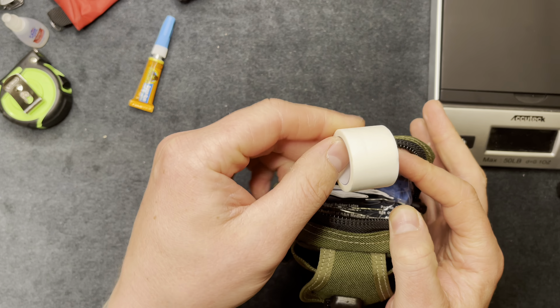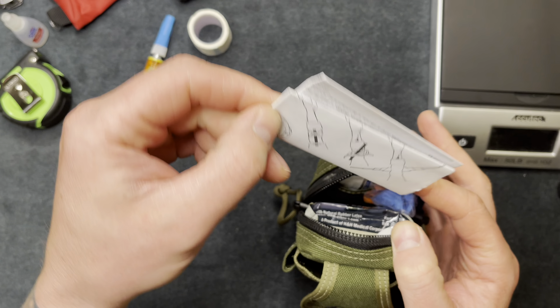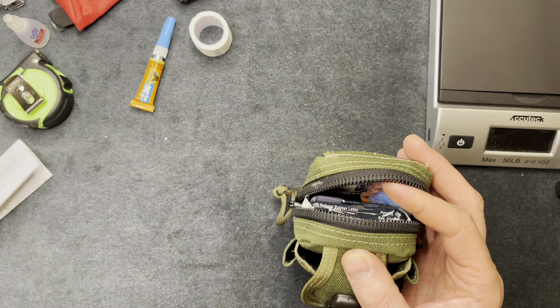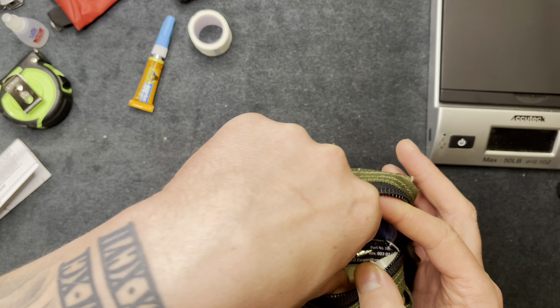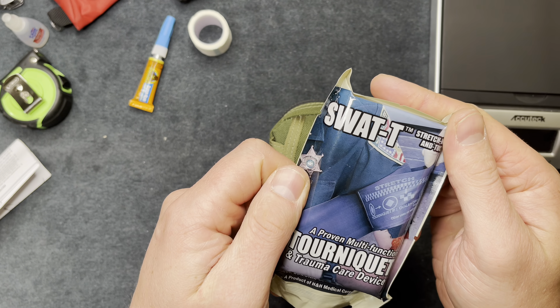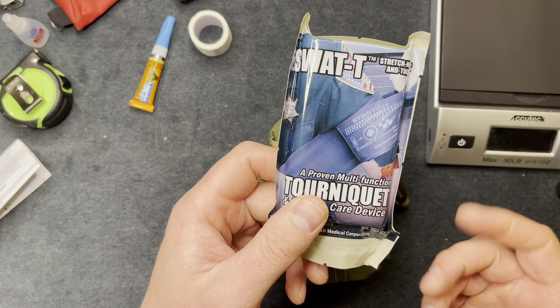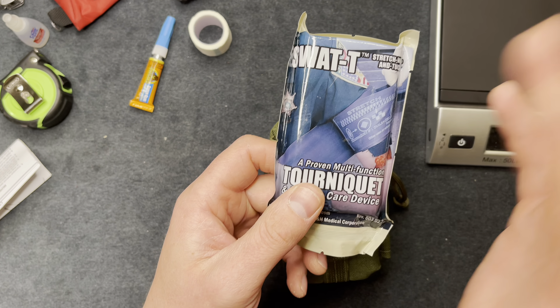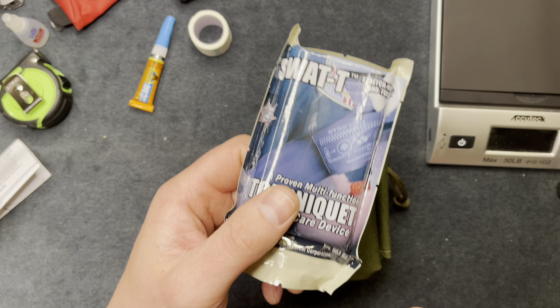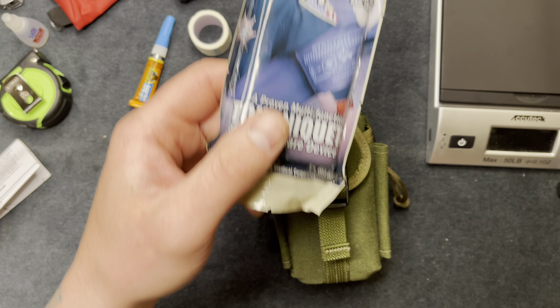Up top I have medical tape. In the middle there are instructions on how to apply a tourniquet. I also have a SWAT-T tourniquet — this is good not just as a tourniquet but also as a wound dressing wrap and a sling. I've watched some videos on how to use it; I've never used one in the field but it looks like it should work well.